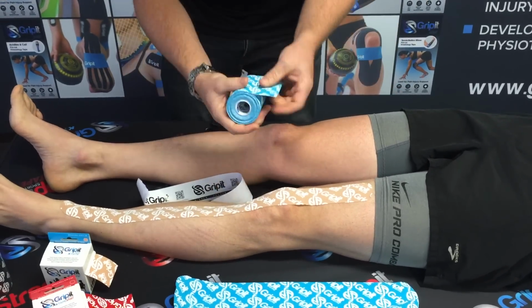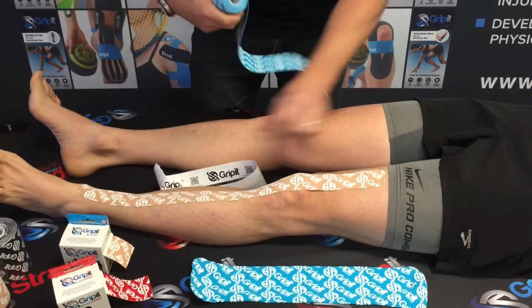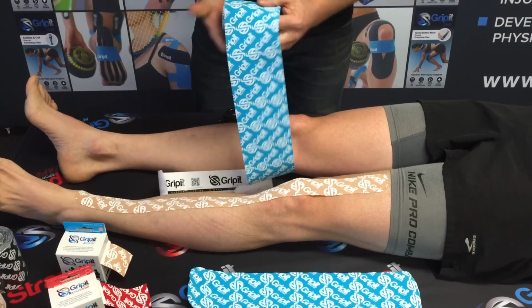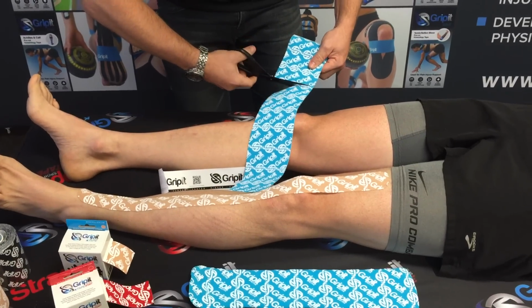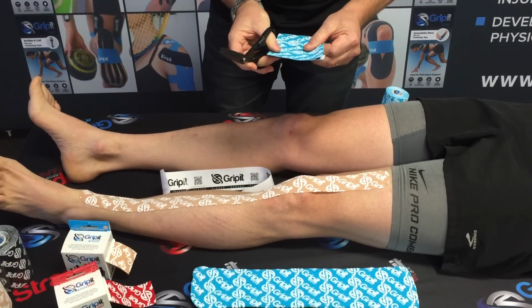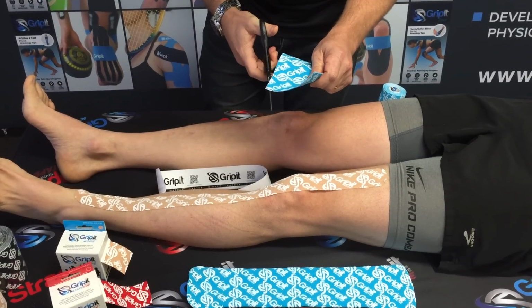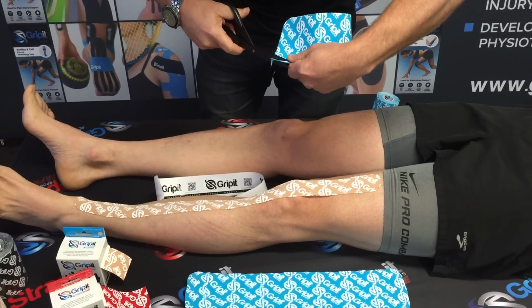And then we may choose to do maybe a 7.5 or a 10 centimeter overlayer, or even just 2 5s. Up to you, depends what you feel more confident with. And today we're going to do the 10 centimeter on top. Okay, so I usually cut this just a little bit smaller because the nature of this tape is that it's got a greater surface area because it is 10 centimeters across.